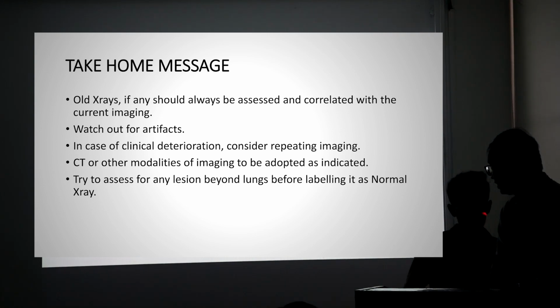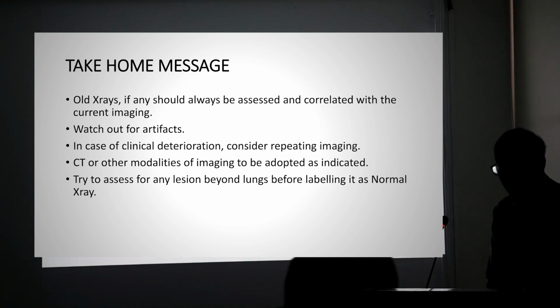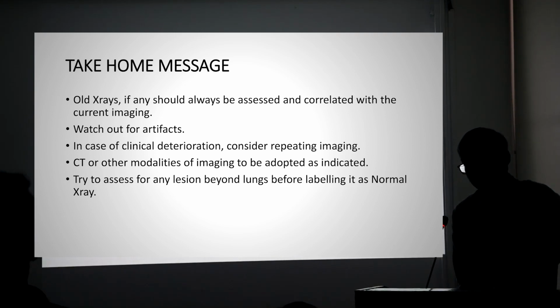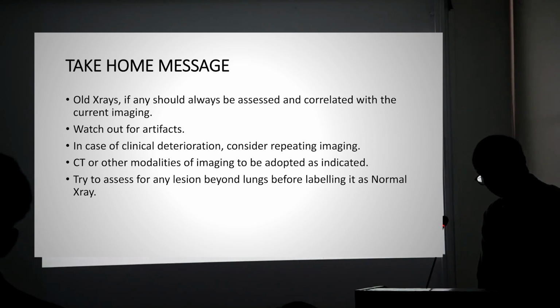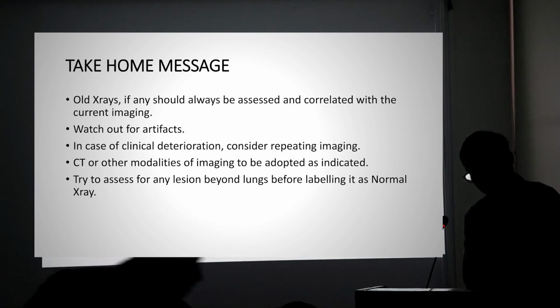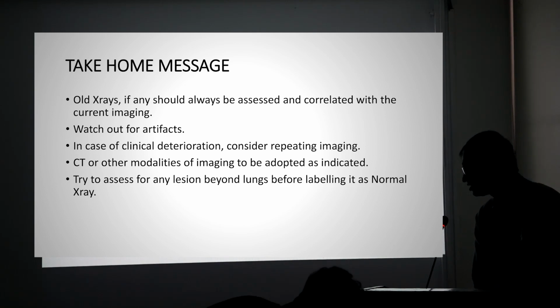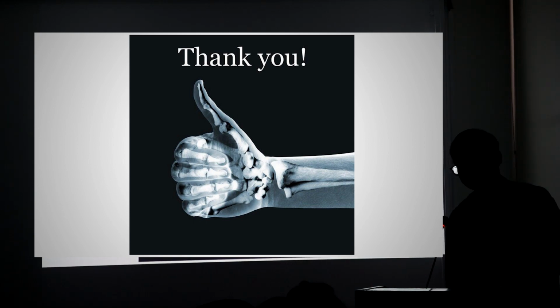deterioration, consider repeating the imaging, especially in the ICUs, and we should never write CT thorax like we write CBC for the patients. We should always do CT thorax whenever it is indicated. And sometimes we restrict ourselves to the lesions we see in the lung only. We have to always think about any lesions outside the lung parenchyma. Thank you.